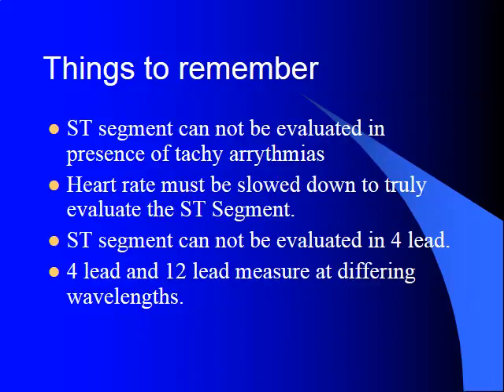Also, remember that the ST segment is very difficult to evaluate in tachyarrhythmias, so the heart rate needs to be slowed down to really get a good baseline of what the ST segment looks like. The ST segment should never be evaluated in the 4-lead ECG. 4-lead and 12-lead measurements are at different wavelengths. Diagnostic criteria for the ST segment needs to be done using a 12 lead. We are not able to determine the true ST segment, whether it's elevated or not, by just a simple 4 lead.